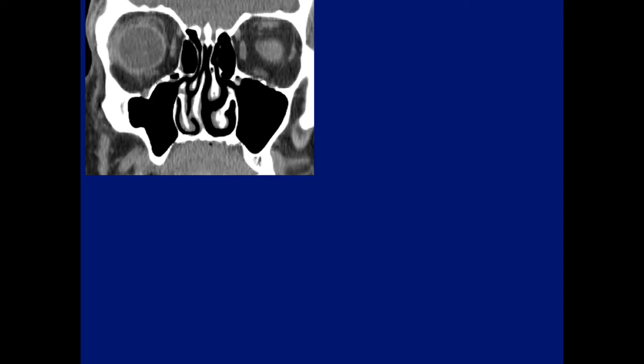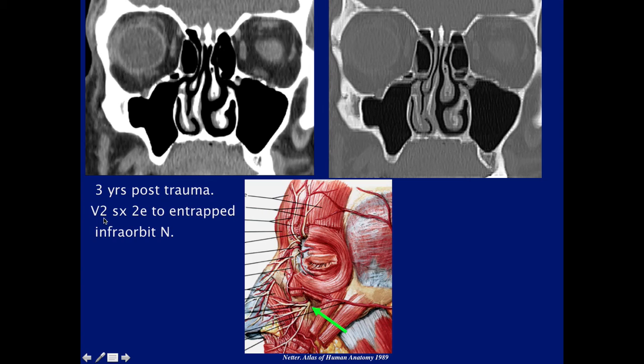The abnormality is the right infraorbital canal — it's fractured. This patient was three years post-trauma and had V2 symptoms due to entrapment of the infraorbital nerve. We can see the fracture here — this is a chronic fracture. If we look at the diagram, this would be the location of the maxillary division supplying the nose and upper face. This was a chronic fracture compared to the normal side.